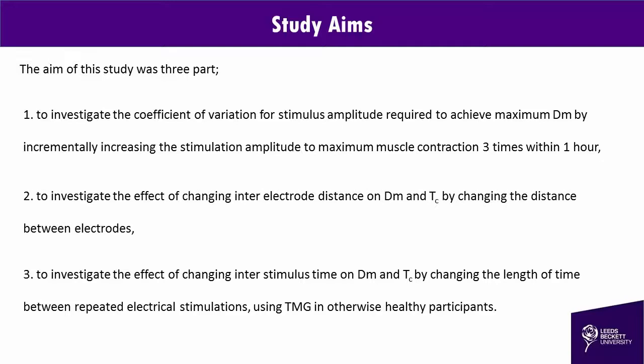The next part was to look at inter-electrode distance. I wanted to vary the distance between the electrodes on the rectus femoris and see if it had any effect on displacement and contraction time. And then likewise with the interstimulus interval time, I'm going to vary the time between consecutive stimulations and see if it affects displacement and contraction time.